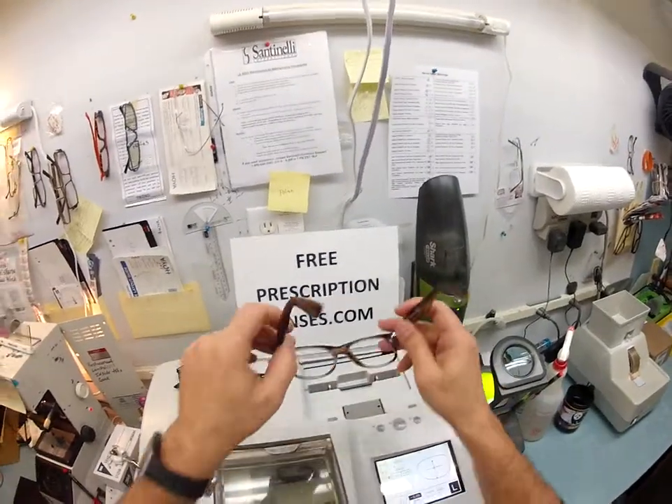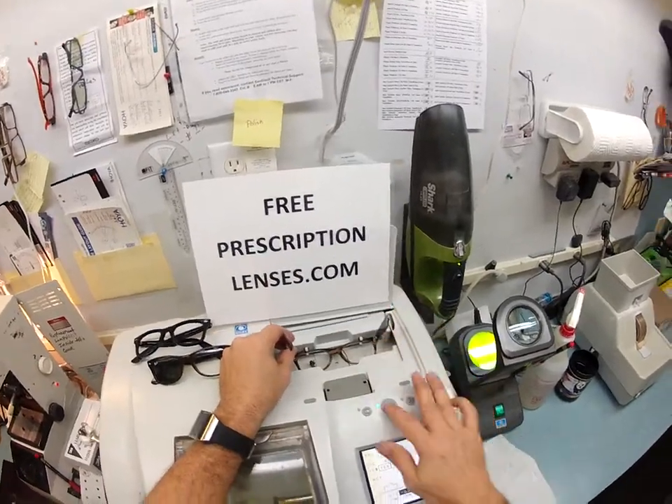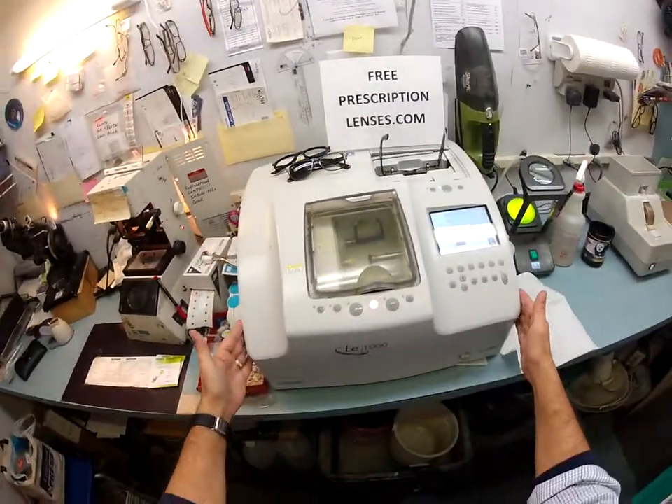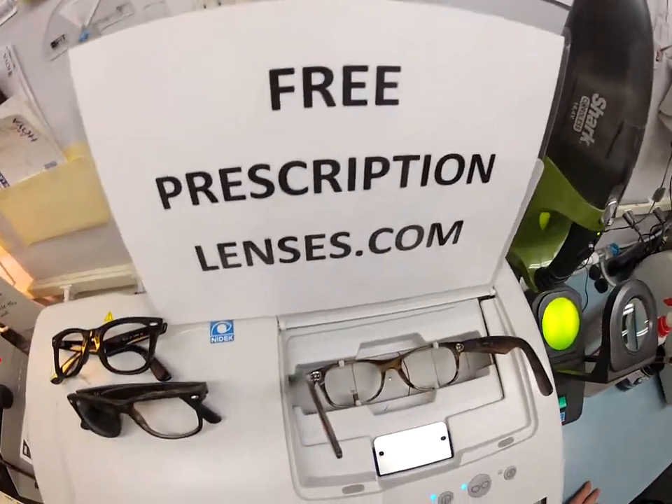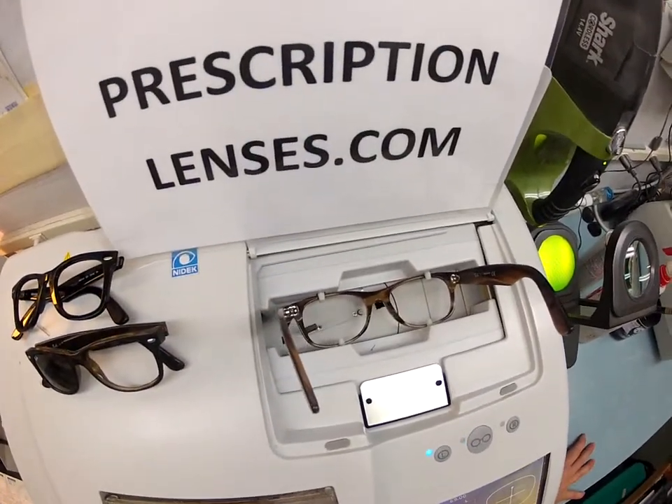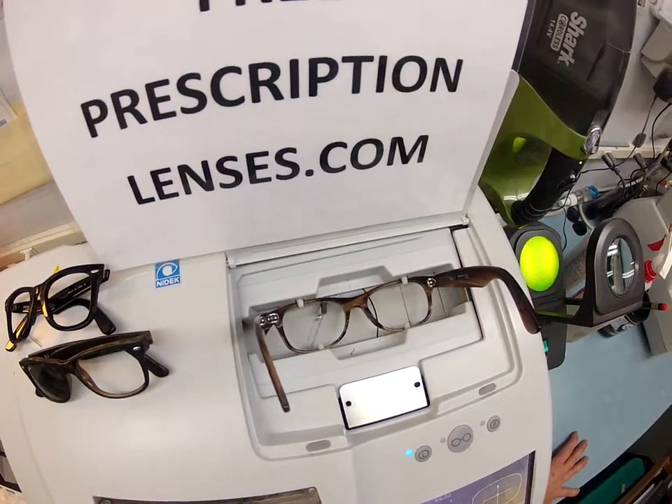The first thing I'm going to do is take the frame and put it into the tracing element of my Santinelli LE1000 patternless edger. It is now tracing the shape of your left lens, and it's going to pop over and trace the shape of your right lens.